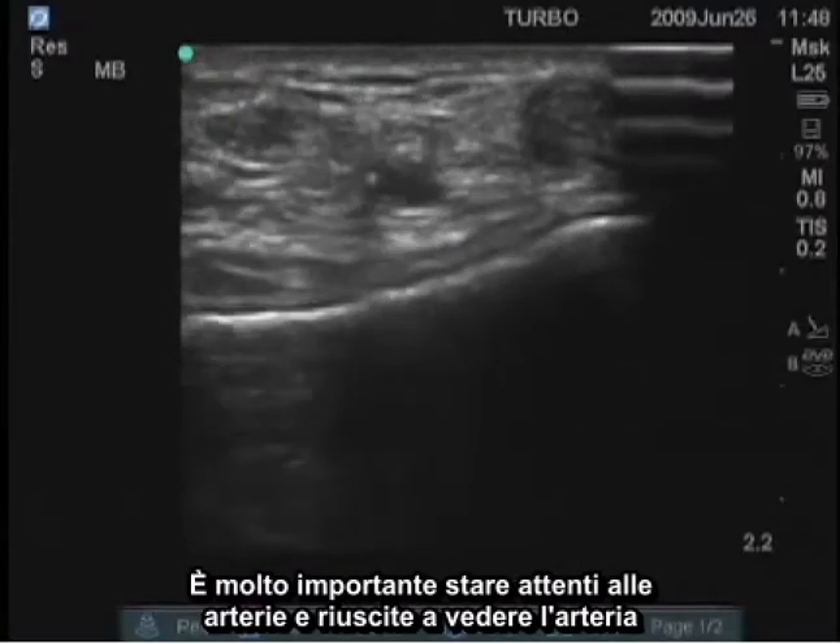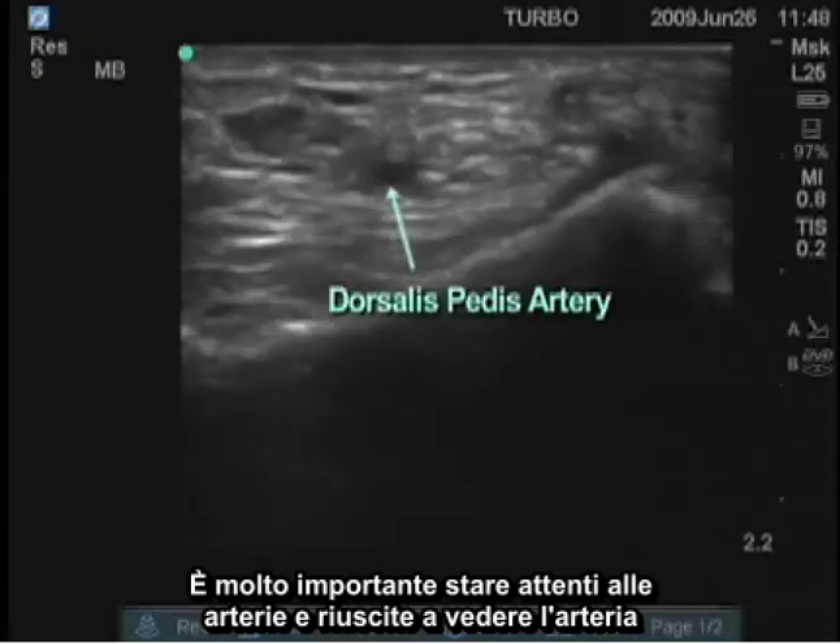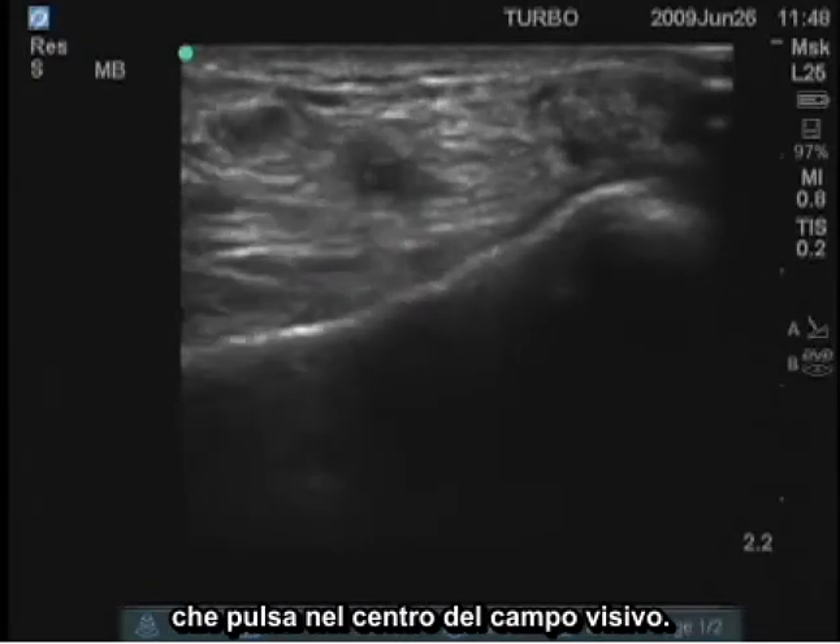It's very important to watch for arteries, and you can see the artery pulsating in the center of the field.